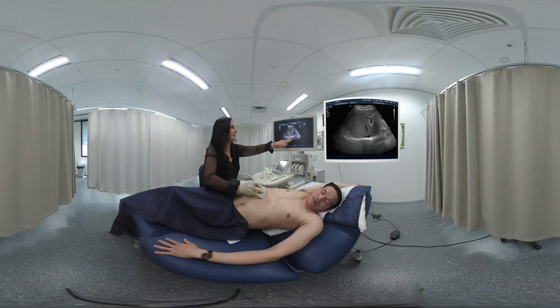So this liver measurement, you're allowed to have it up to 12 to 15 centimetres, just depending on the size of the patient. So we'll just start our assessment of our right liver again. Big breath in again. So we're in a longitudinal plane here. And one thing that I can see in this patient is we're getting a lot of shadowing here from the gallbladder. Now, this gallbladder is actually pathological.